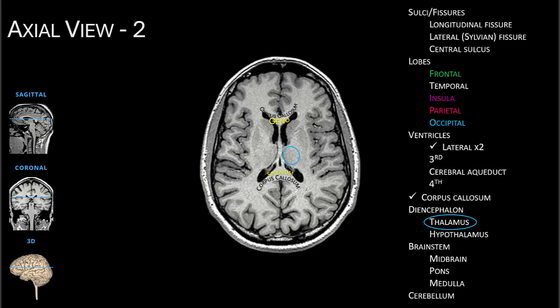Cerebral structures: we still see the frontal and parietal lobes. Now the insula emerges. Posteriorly, we see the occipital lobe.